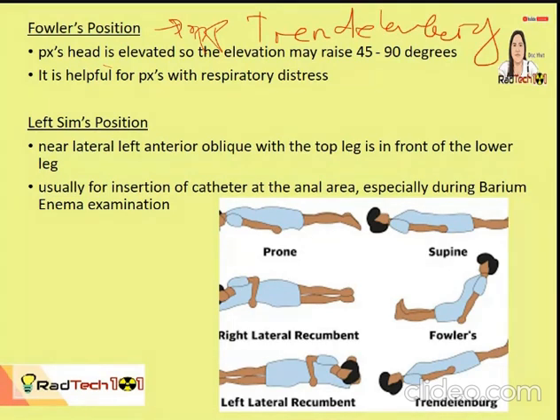So, for patients naman na nahihirapang huminga with respiratory distress. So, left Sims position. So, para siyang lateral, pero hindi naman lateral. Hindi rin siya oblique. Near lateral, left anterior oblique with the top leg in front of the lower leg. So, I have picture there later.